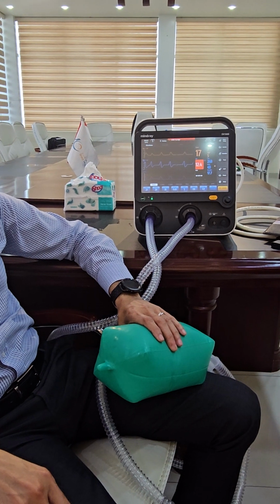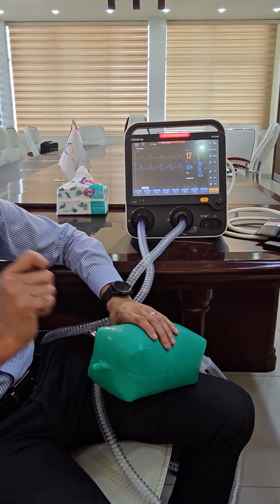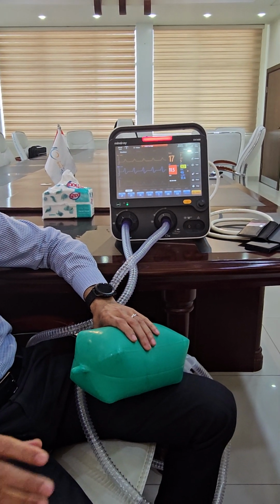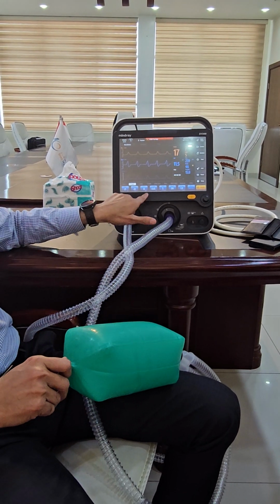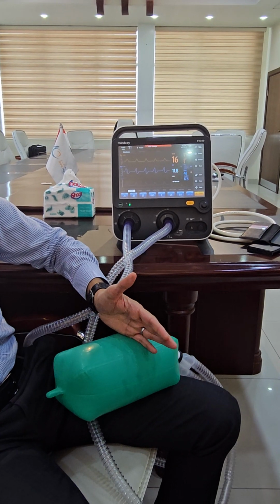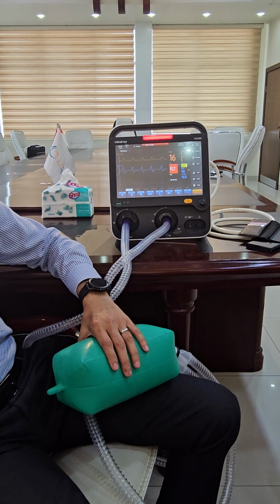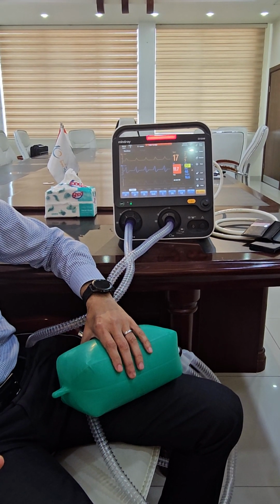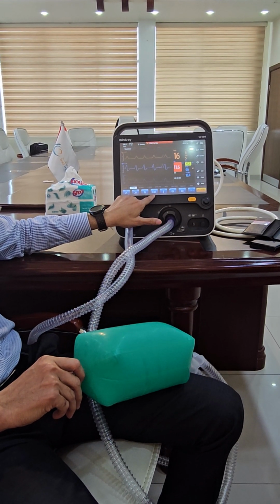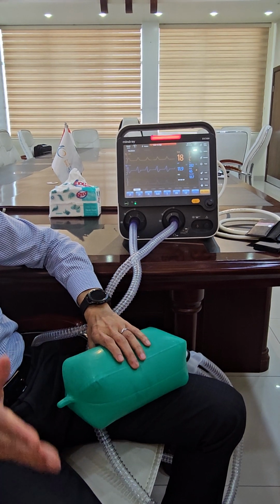So if the patient achieves this flow, help. If the patient achieves this pressure, help. Clear? And then we have to set the rate. But remember, the rate is over a minute, and the minute is 60 seconds. So if we tell the ventilator the rate is 35 times, we'll tell the inspiratory time. So let's say the inspiratory time is 0.65.